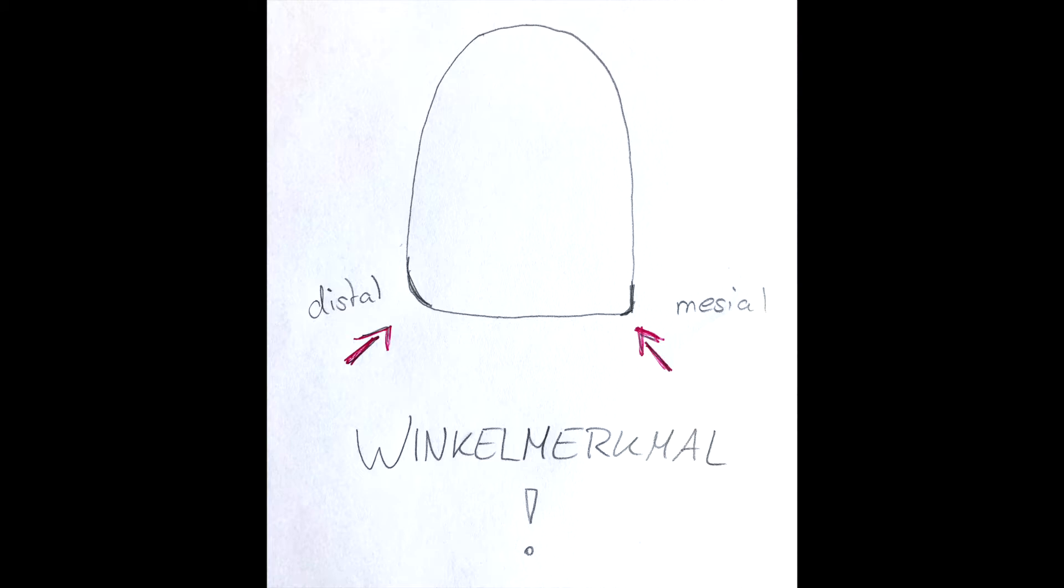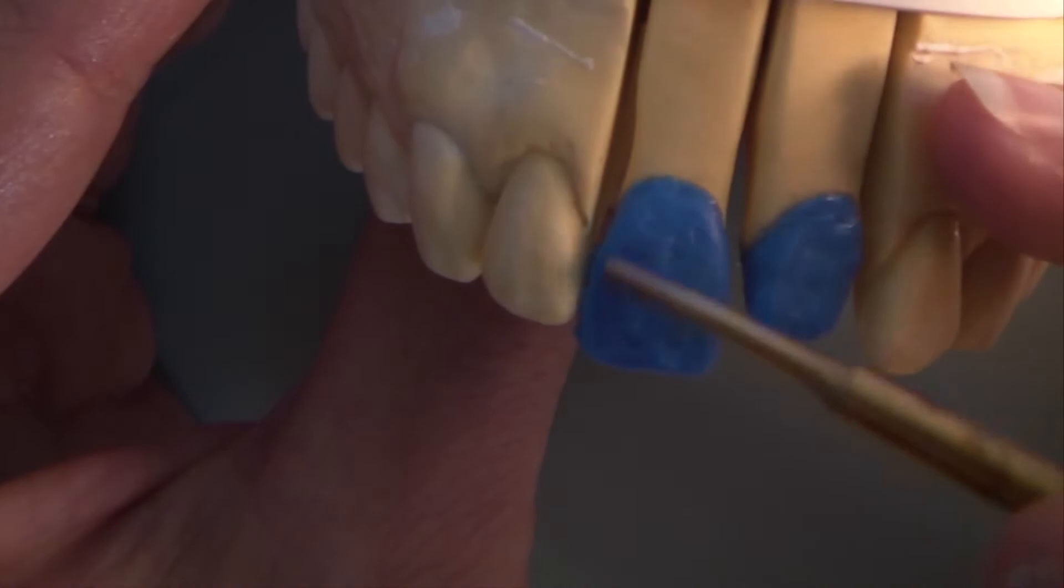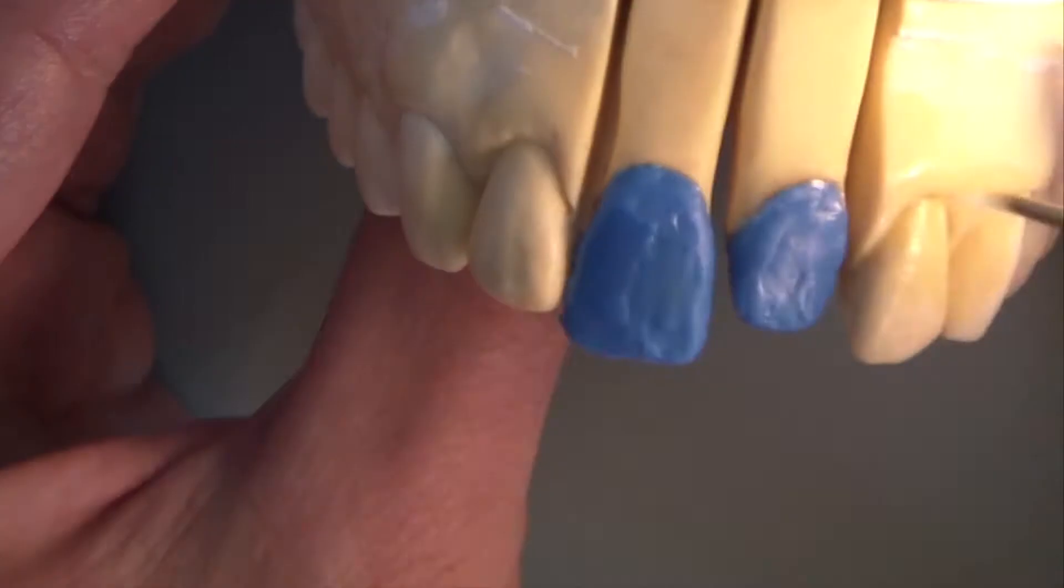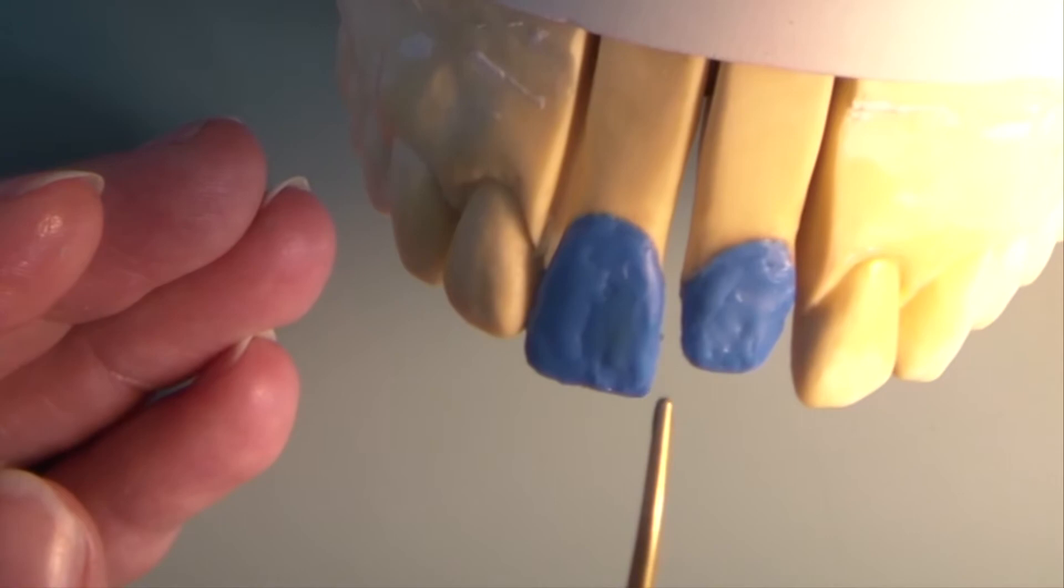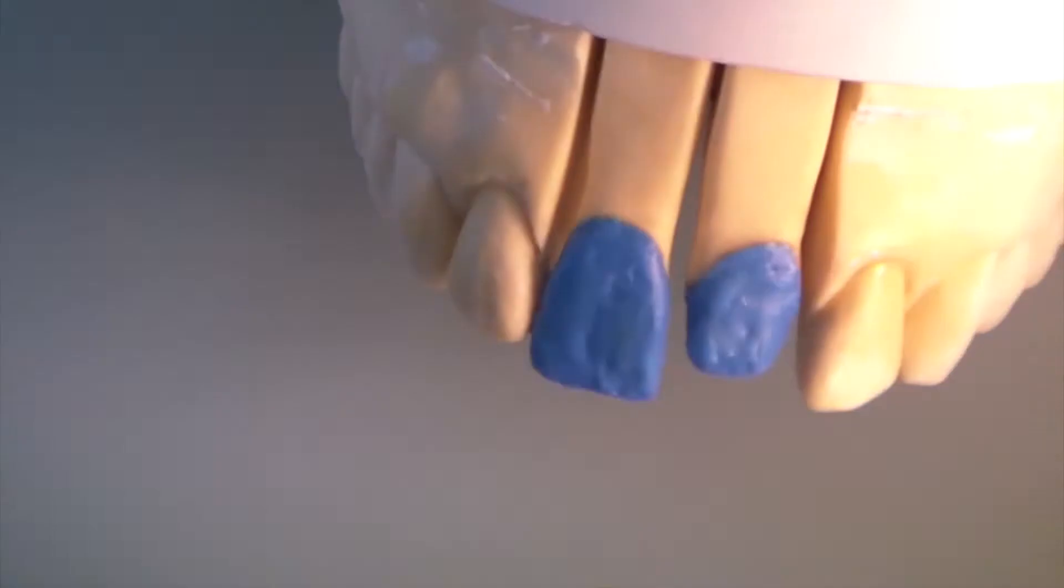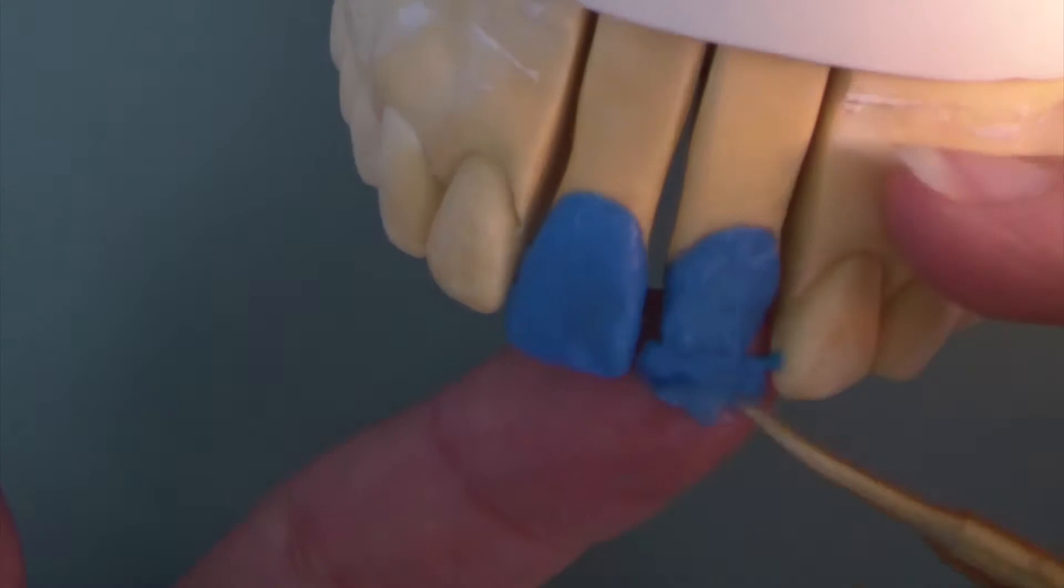I pay attention to my desired angular features, rounded distal and pointed mesial. Also I already indicate the longitudinal furrows between the mamelons. And now the same procedure with tooth 21.